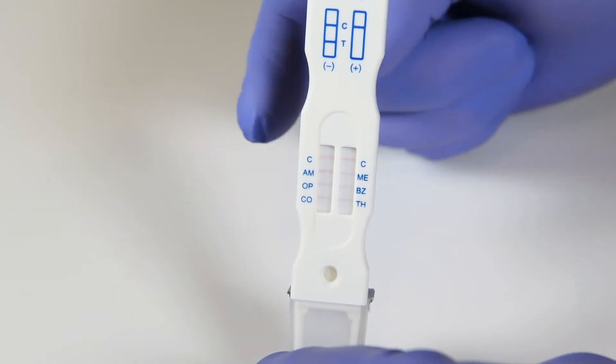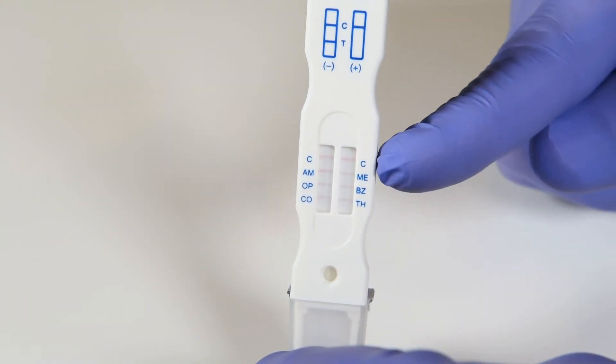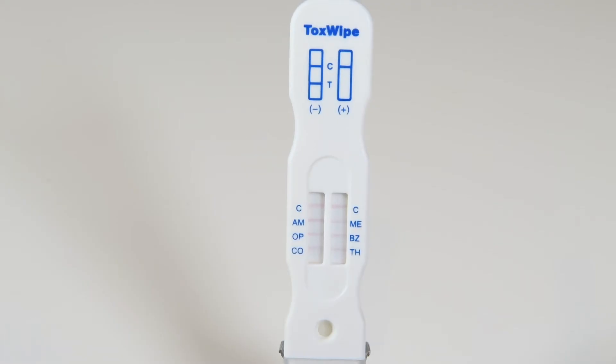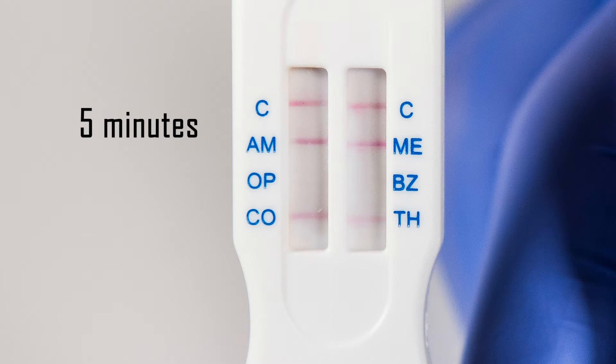Make sure the test is valid by reading the C line first. Only read results if the C line appears. If all lines appear after 3 minutes, the results can be considered negative. If lines still do not appear at 5 minutes, the result is considered positive.